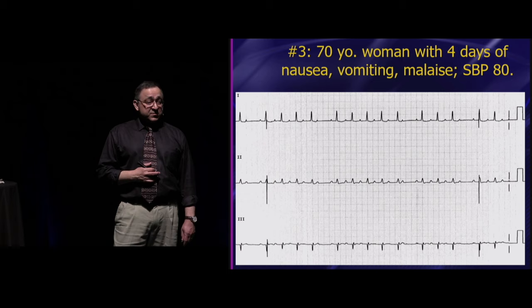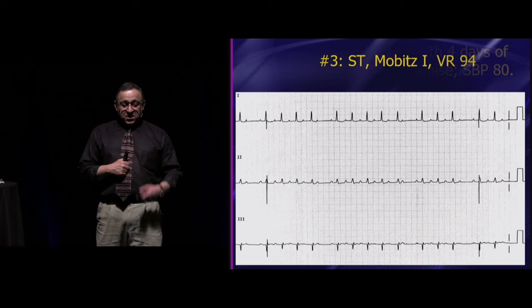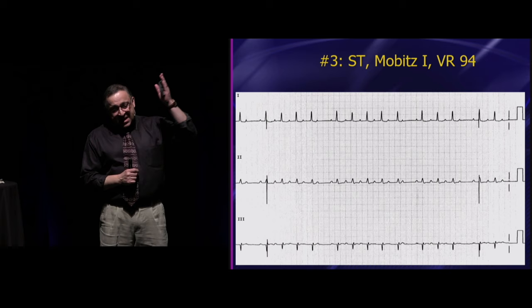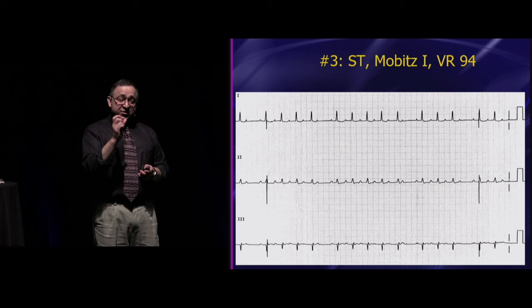All right? So that's a little bit of a curveball. Again, remember, treatment is entirely based on what the ventricle's doing, not the atrium, not the AV block. It's all about the ventricle. If the ventricle's beating at a pretty good rate, then the rhythm is not causing the instability. It's something else.